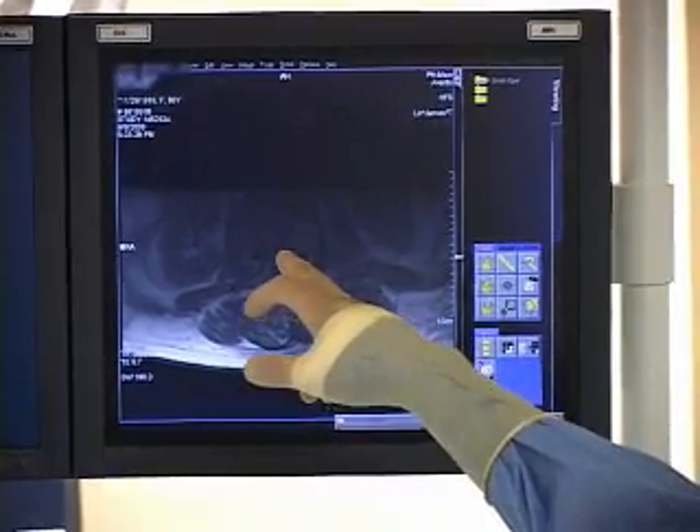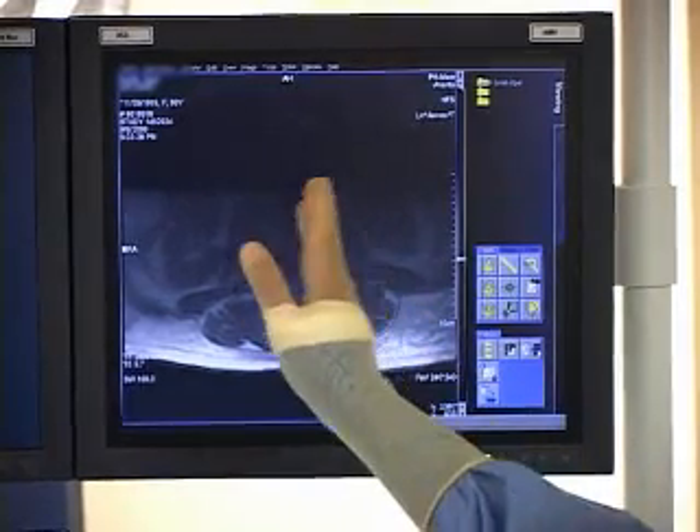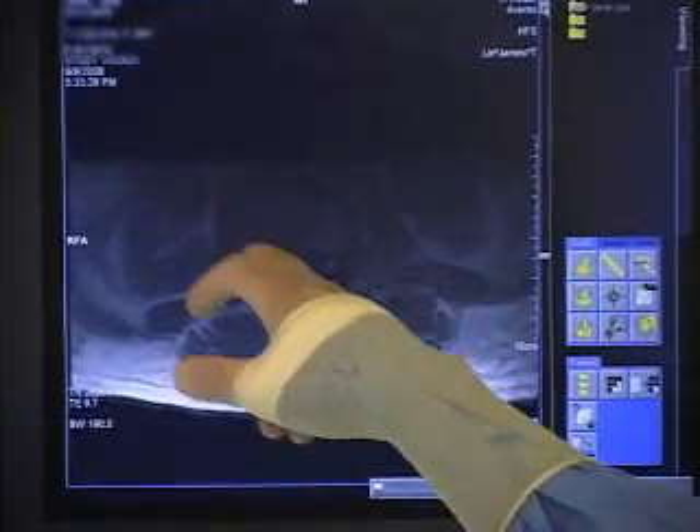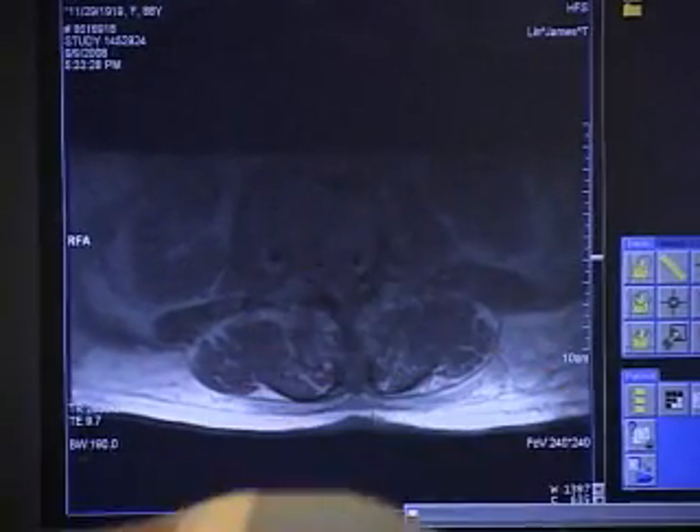This is a proton density sequence. There's an ill-defined area of soft tissue in the right hemivertebra, just adherent to the junction of the pedicle and the body. This is the area here — this is exactly where my needle is right now.